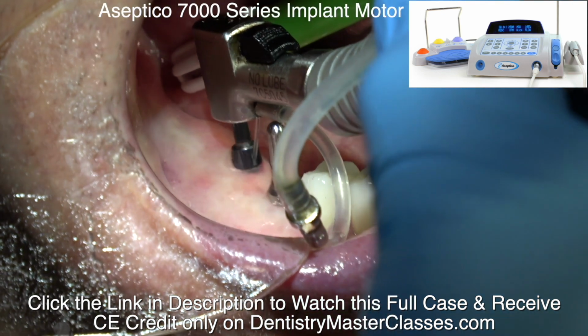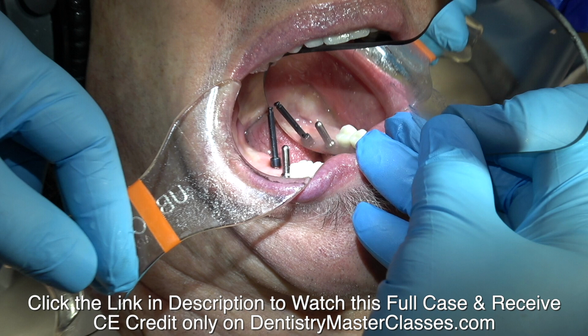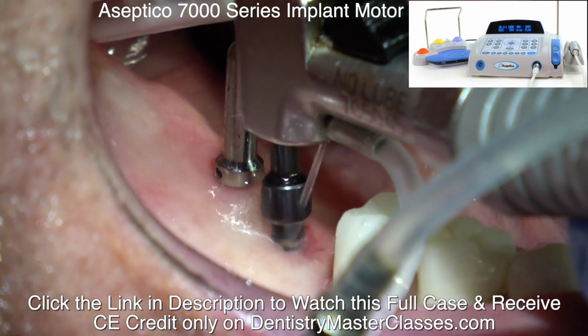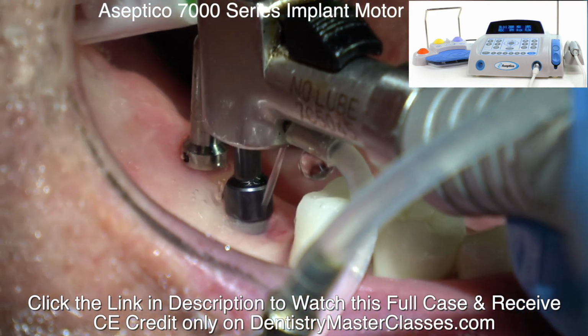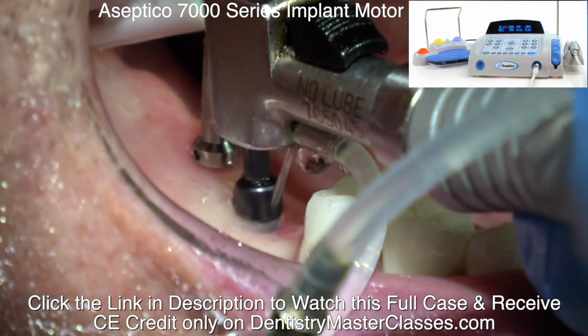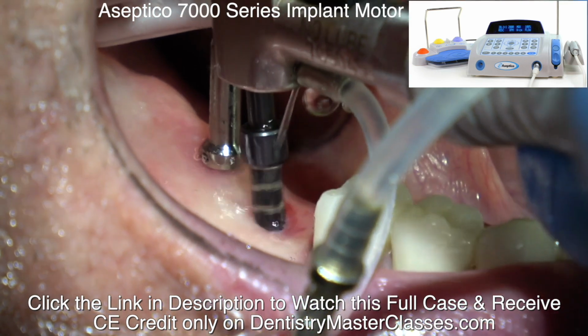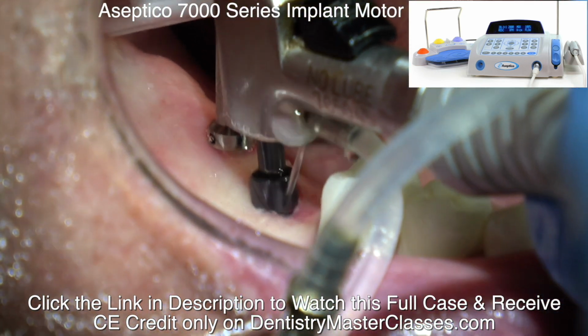Again, checking the parallelism of them and keep moving. I'm switching, paralleling this piece into the other osteotomy, so I've always got something to mark that, so I'm keeping them basically parallel to each other as much as I can. See, that's pretty parallel.